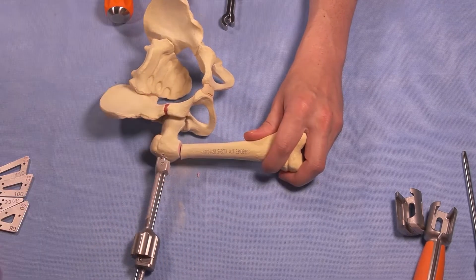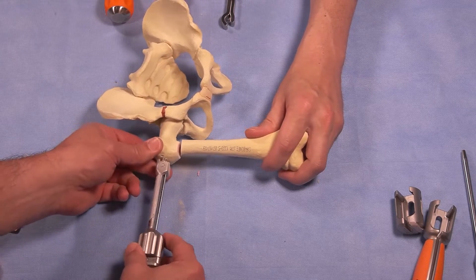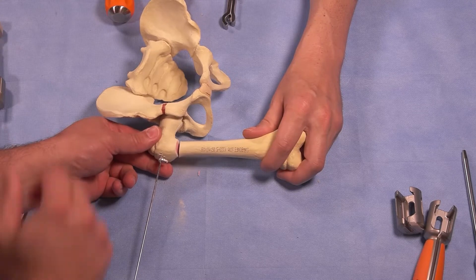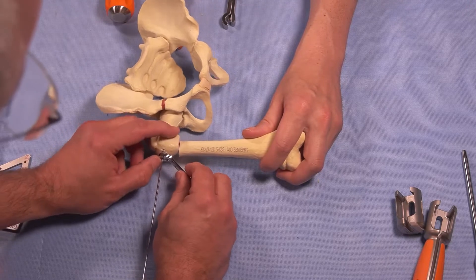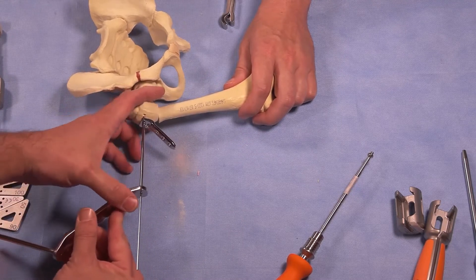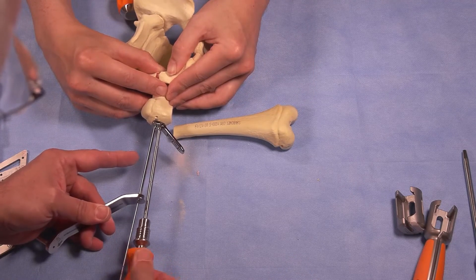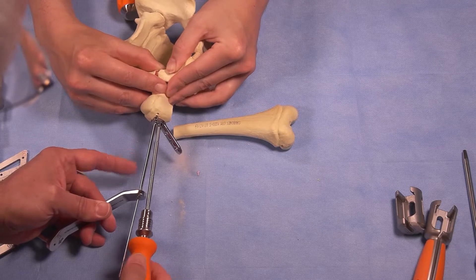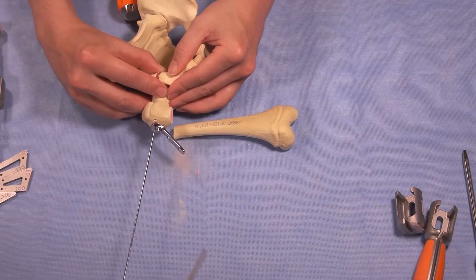The osteotomy is complete. Another beauty of this system is that you're not putting a chisel into a moving fragment or putting your blade plate back into a moving fragment, because everything is already secure. I can now place my plate onto the chisel blade. You place your multi-axial guide onto the plate and it automatically locks it into position. You take your locking bolt and connect your plate to your chisel blade. At this point, the insertion is complete — it will have significant torque on it and is extremely strong.